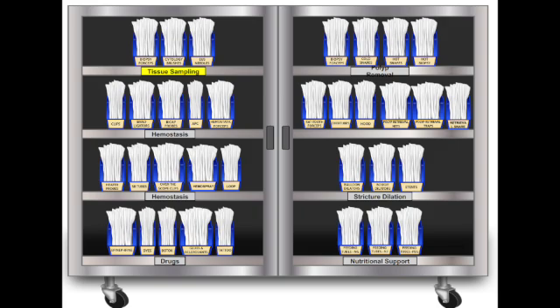And that's not all. That same simple needle is used to inject saline, often mixed with a dye like methylene blue or indigo carmine. Why would you do that? Submucosal injection. You inject it underneath a polyp. It lifts the polyp up, creates this fluid cushion between the polyp and the deeper muscle layer. Making it safer to cut off the polyp. Precisely. Aids safer resection, especially for larger or flatter polyps.